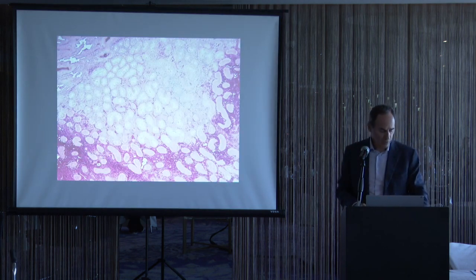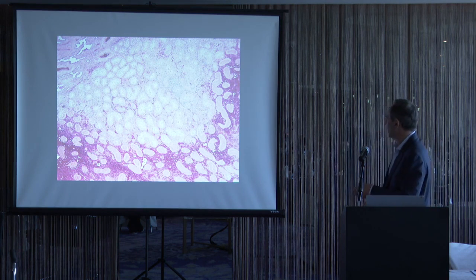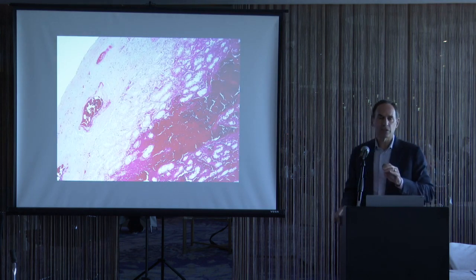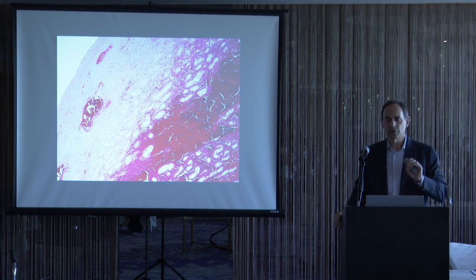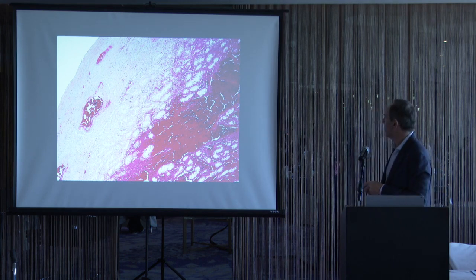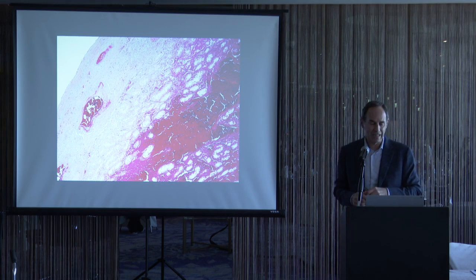So this is what you get with an infarct in the testis. It's a localized area, just like an infarct anywhere else, with a hemorrhagic rim. And then anytime you see an infarct in the testes, you should always look for the vasculitis. And the vasculitis is typically going to be around the tunica albuginea. And what you're looking for classically is a bright pink fibrinoid necrosis of the vessels. That's polyarteritis nodosa-like vasculitis. They'll stand out at low power.